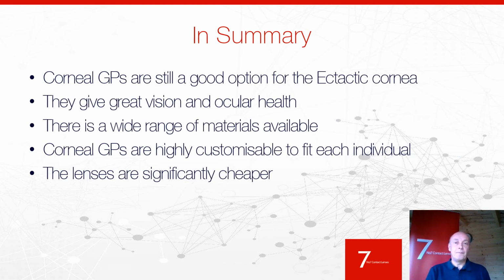So in summary, corneal GPs are still a very good option for the ectatic cornea. They do give very good vision and they maintain excellent ocular health. The lenses can be made in a wide range of materials and they are highly customizable to ensure that the fit for each individual is accurate. And finally, the lenses are significantly cheaper than some of the other lenses that are currently available.